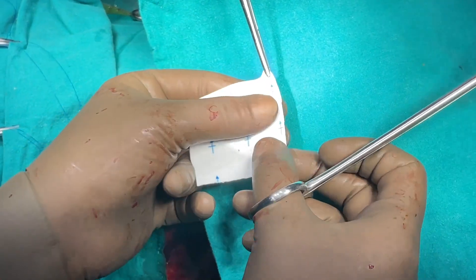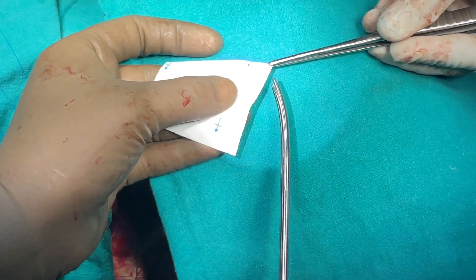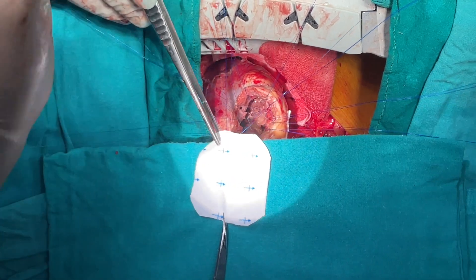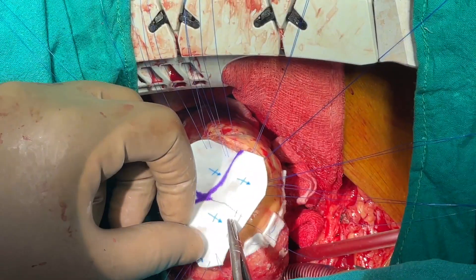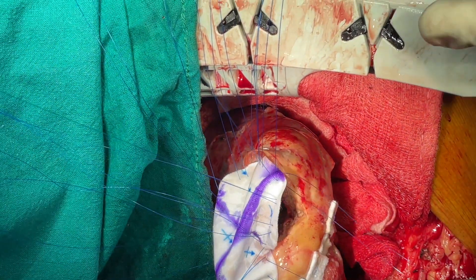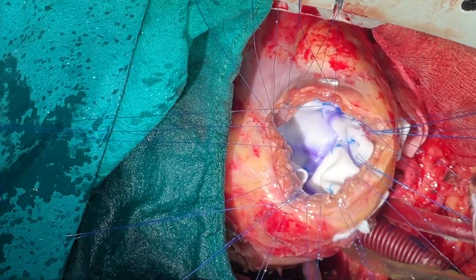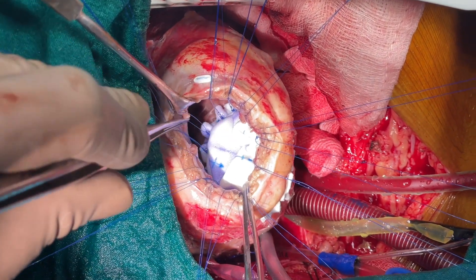We close the defect with a Dacron patch; however, bovine pericardium can also be used for the same. The patch is fashioned keeping in mind that it should be large, since the sutures are coming out far from the edge of the defect. The sutures are now passed through the patch. The patch is gently lifted, lowered into the left ventricular cavity, and the sutures are tightened. We tend to keep the patch loose so that the tightened sutures are not under tension when the LV is contracting.